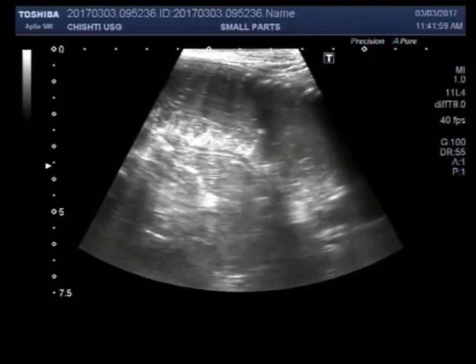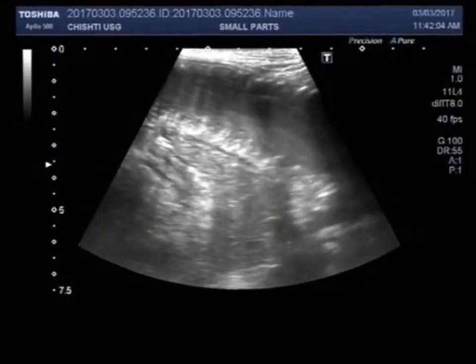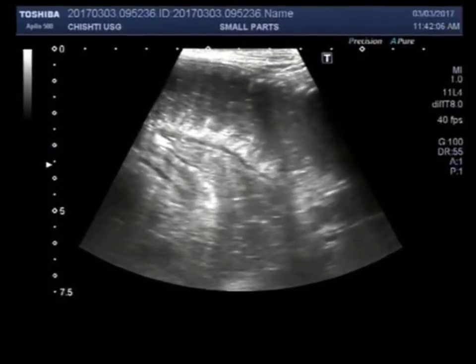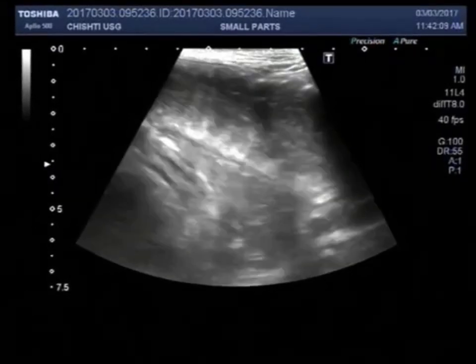So when you see a report with this back and forth movement, dilated bowel and increased peristalsis, you are sure it is intestinal obstruction. And also the ultrasonography can tell you the specific area where the obstruction is, and whether this is a small or large bowel obstruction.